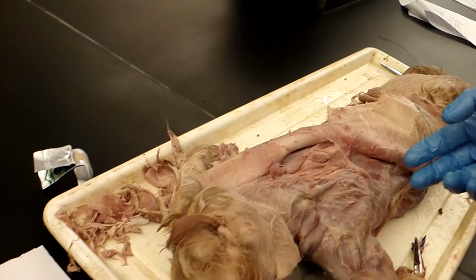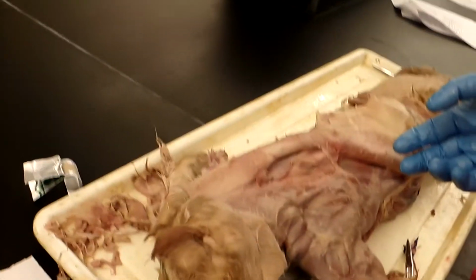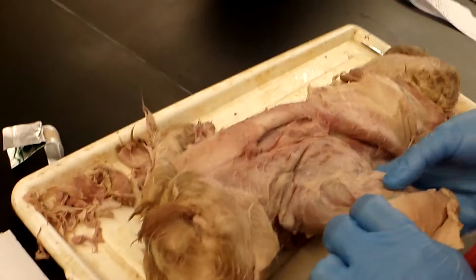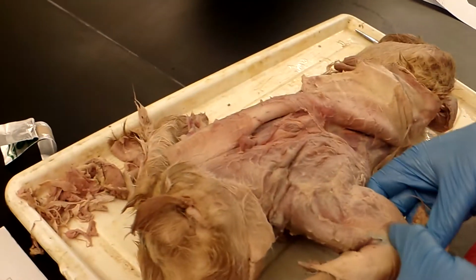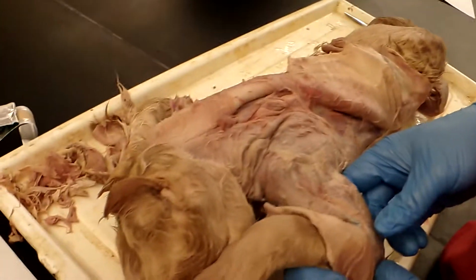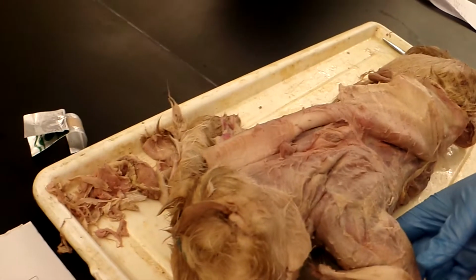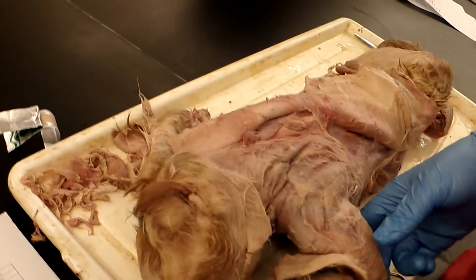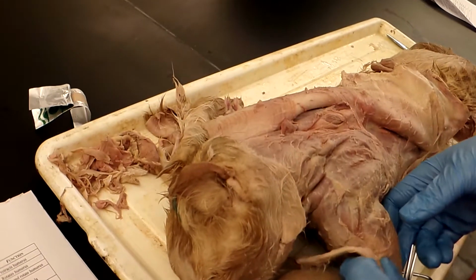on the back legs. It's okay on the front legs. Should still be in the shoulder musculature, but I can't find it. I know, I found it.